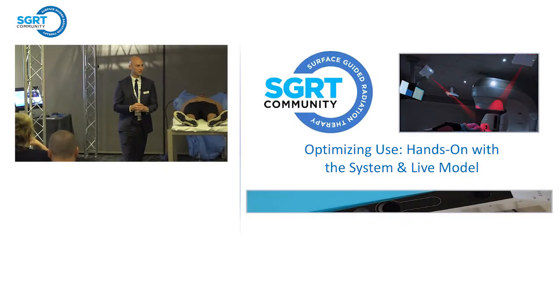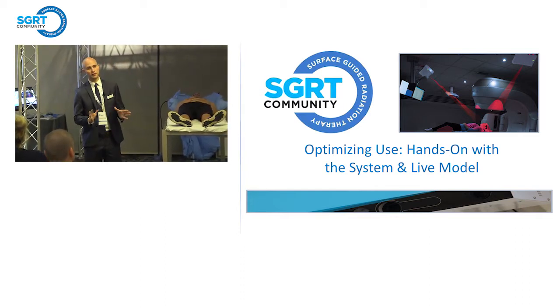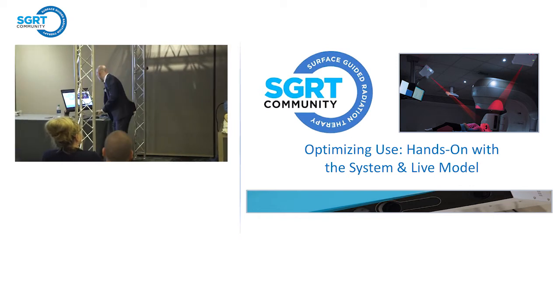This session is mainly going to be talking about how to optimize use with the surface guided system. So we're going to do a lot of hands-on. We have a live model here with us, and it's going to be really exciting to get going with that. So I'm going to grab my little clicker here.